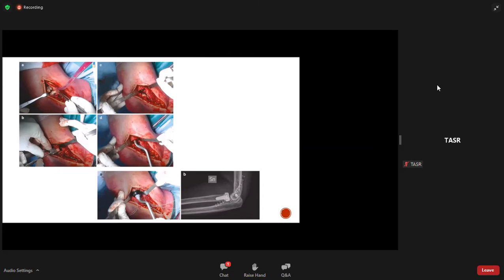If the LCL is intact, I suggest you not do anything on the LCL, and the space to work in is more limited, and you cannot dislocate, of course, the radial head. But as soon as you remove the pieces, the fragments of the radial head, it's going to be very easy to see the spaces and to work on the radial head. Another very nice step that you can do at this point is to see nicely the sigmoid notch, because again, this is something you will see nicely later, or before checking the presentation we have prepared on Sawbones.